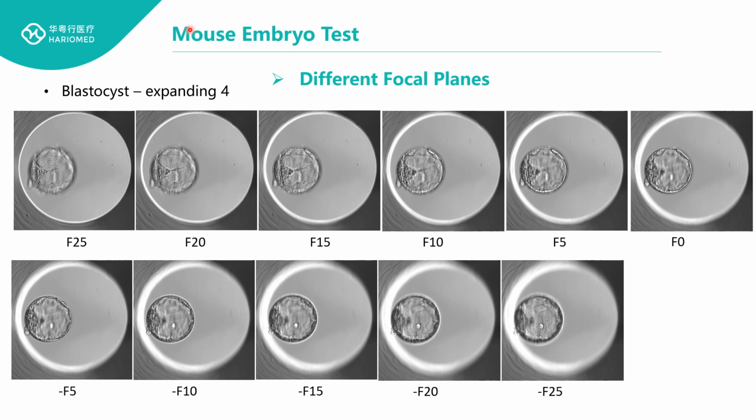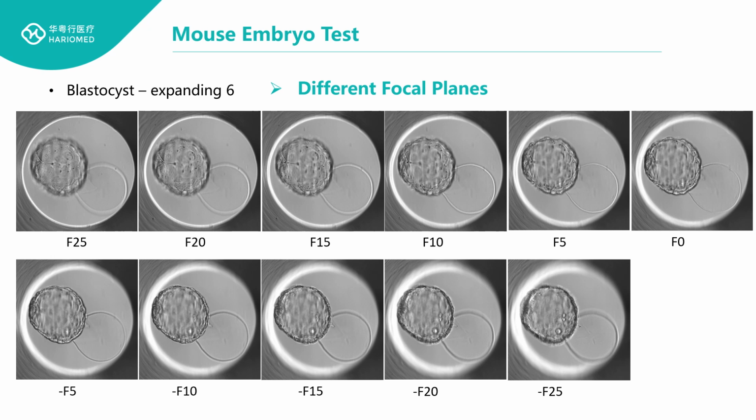So with the pictures and time-lapse video of each embryo, we can assess the culture process within the video, which will be more convenient and direct than the C200.